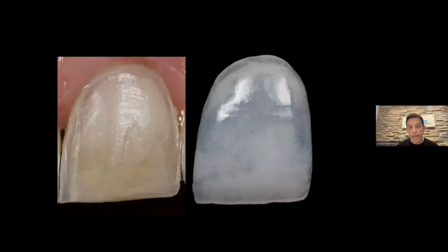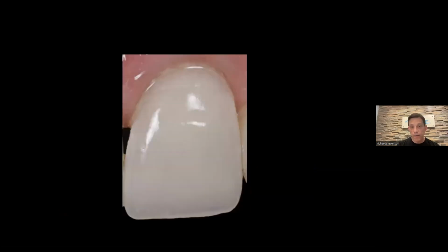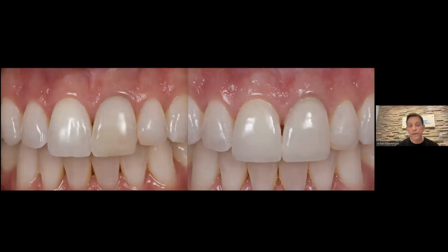So the veneers were done by Chang, one of Dr. McLaren's proteges again, and Chang made feldspathic veneers very, very carefully so that he could block out the shade of the teeth and try to normalize the final look with a very conservative preparation. It was not an easy case for him to do, but I think he did okay. I think the veneers are fine.